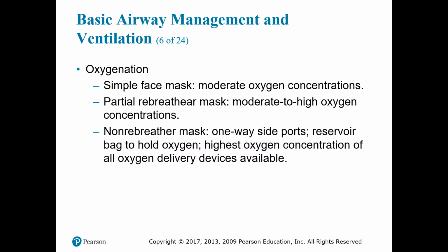They're commonly used in the EMS field, of course, for initial management of patients with high oxygen requirements. Any patient who requires a non-rebreather should be closely monitored for refractory hypoxemia that requires invasive or non-invasive positive pressure ventilation. So basically, you want to watch their respiratory status and their oxygenation to make sure that they are continuing to oxygenate. Make sure that there isn't something else going on.